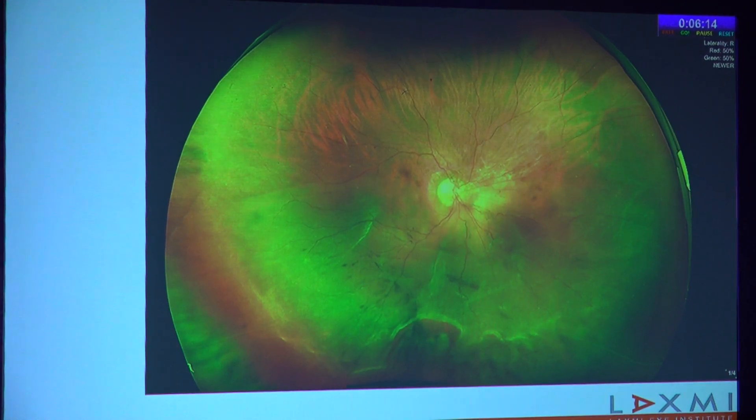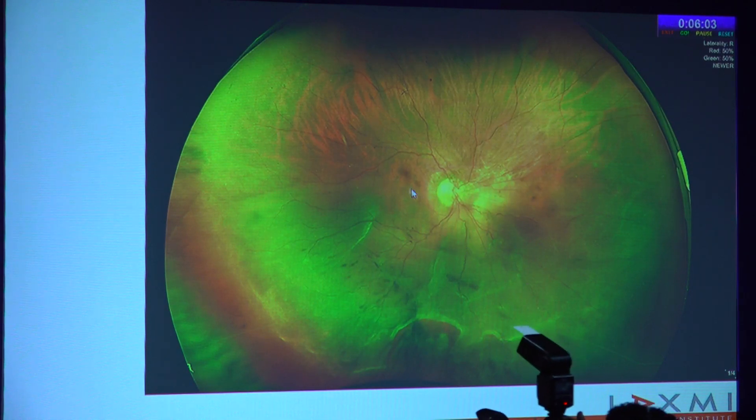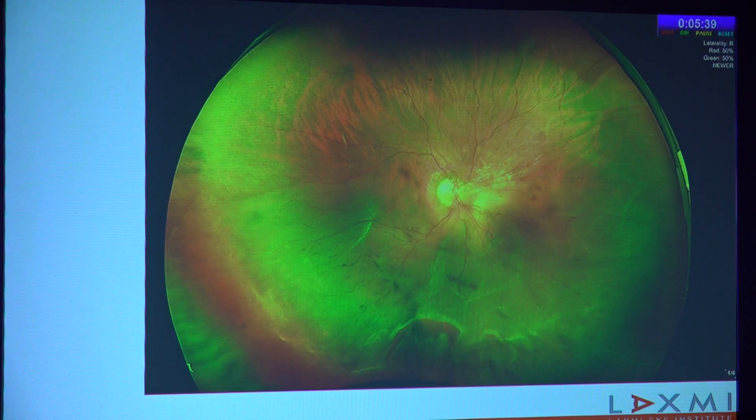Here are some interesting images of rhegmatogenous retinal detachment, where you can see the large horseshoe tear inferiorly with multiple smaller breaks and the extent of the RD. An important thing to understand in all ultra-wide field techniques is that the periphery looks a little magnified compared to what it actually is, and magnified compared to the posterior pole, because of linear magnification and because we are condensing a three-dimensional bowl-shaped retina into a two-dimensional image. So the horseshoe tear in real life is probably not as big as it appears in the Optos photo.